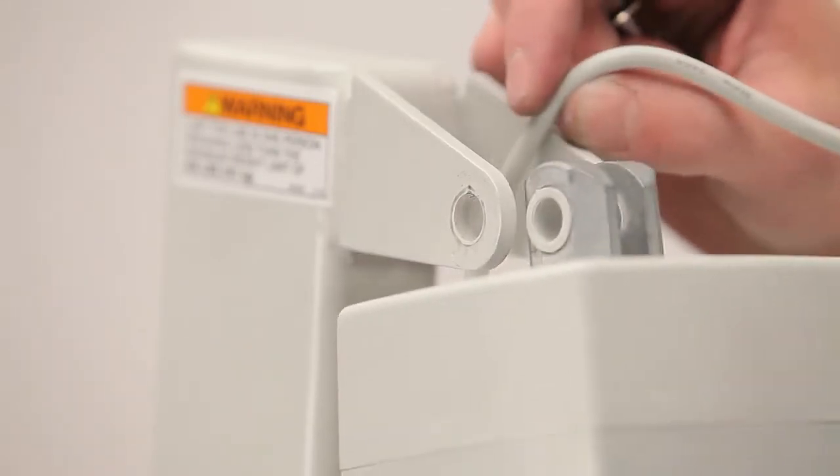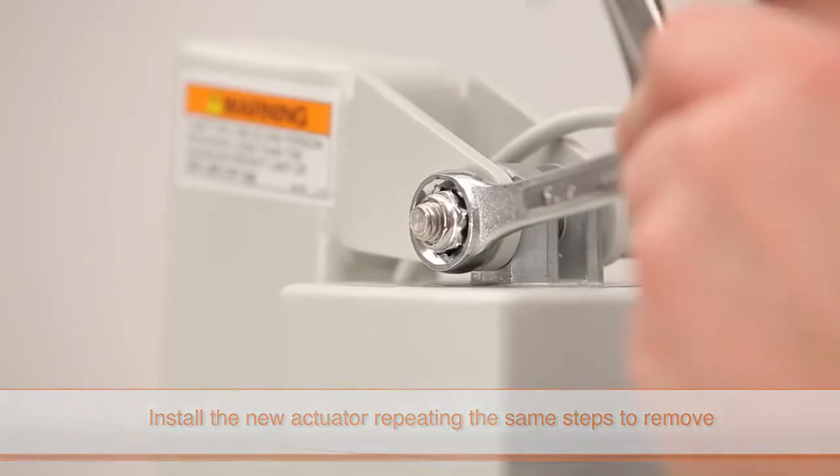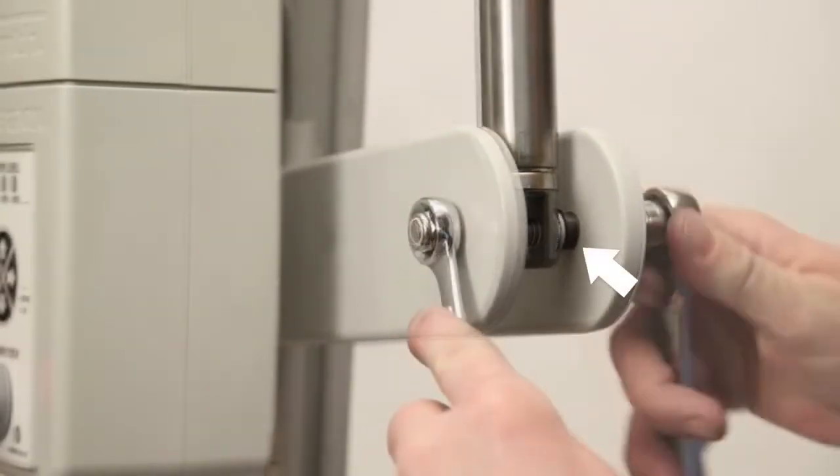Install the new actuator, repeating the same steps used to remove the old one. Make sure the bushings on the inside and the outside of the support arm are installed correctly during reassembly.